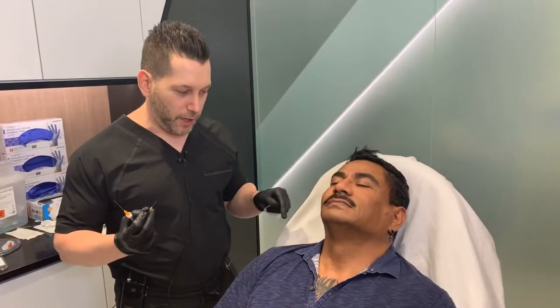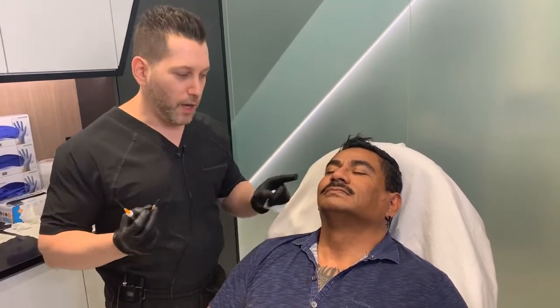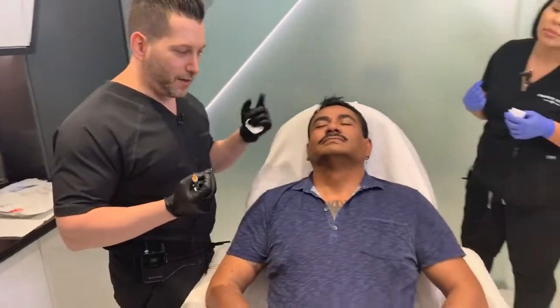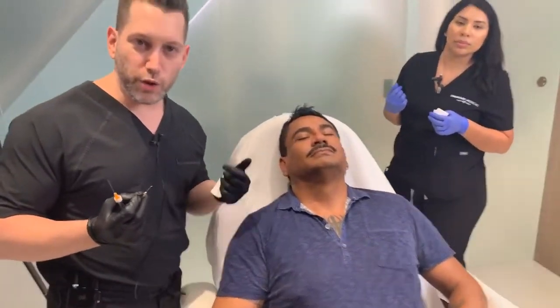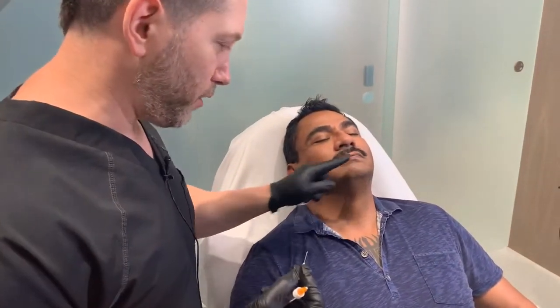We're doing one of our favorite treatments. You guys know, facial sculpting. And what we're going to do today, a patient of mine who's done every so often we do little tweaks. He looks great already. We did a little lifting in his mid-face last time with some Radiesse. And then this time, because he does actually really well with Restylane, using it just in the folds and around the mouth, we're going to do a little touch-up, which he hasn't done for years.